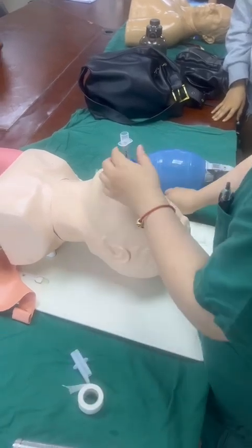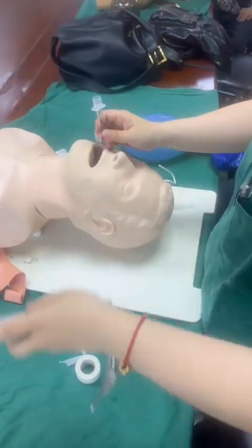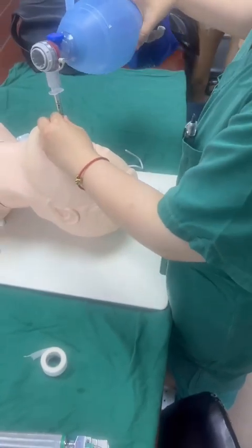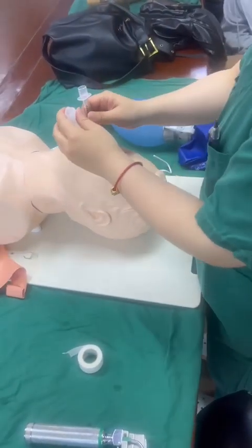Maybe in our tester we can do this one and remove it, and put the teeth cushion, and then put the connector. It's okay. The right one. Yes. Attention. Okay, you can practice.